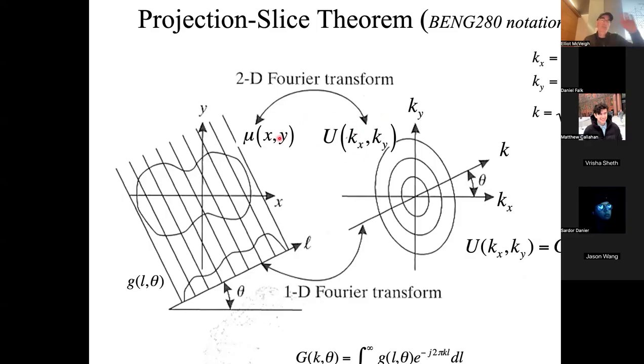And if we precisely know this function, we take its Fourier transform, we can write it down in these rectilinear coordinates. We can also write it down in circular coordinates, or polar coordinates. And it's a natural thing to do because, recall from the projection slice theorem, when we took the Fourier transform, it was a sample through the origin along some radial vector of the Fourier transform.